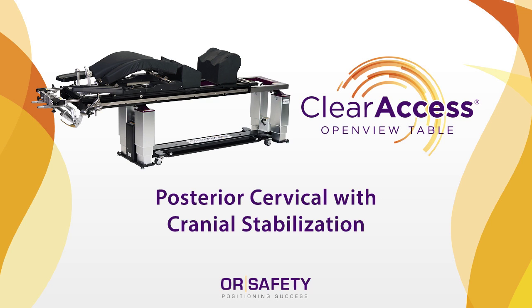This video includes an overview of the entire Neuro Cervical package and detailed setup instruction for the Clear Access table base, prone platform or open top, FlexFrame or Wilson-style frame, multi-directional arm boards, thigh pad, ankle rest, and cranial stabilization adapter with non-OR safety equipment, the Mayfield base unit, and skull clamp.